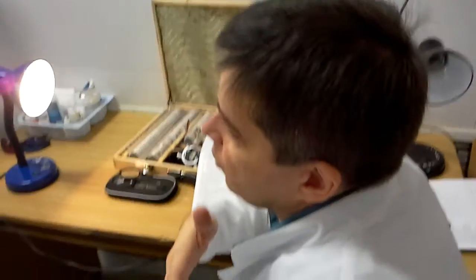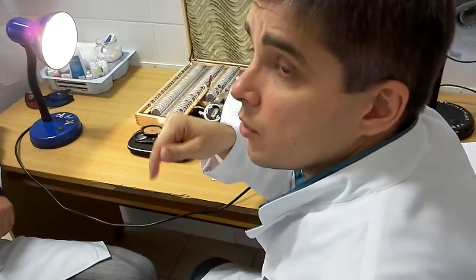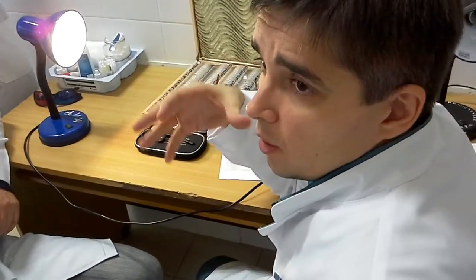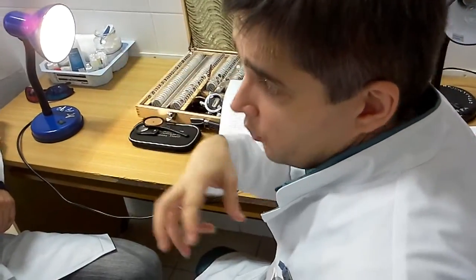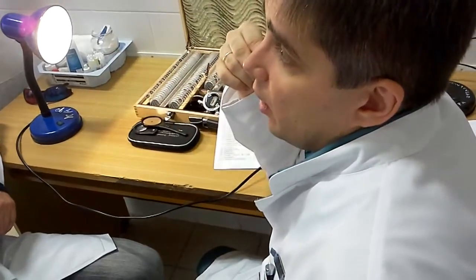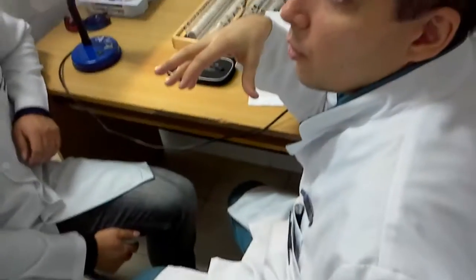Maybe 20, 40 years ago, there was no such equipment, and this test was very important because, for example, a patient with cataract has a rather simple pathology. The only treatment is to remove the opaque lens and to implant an artificial lens. But through this opaque lens, we can't determine the situation with the retina or the optic nerve.